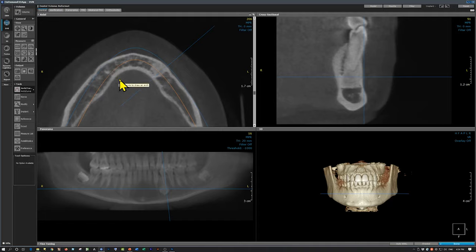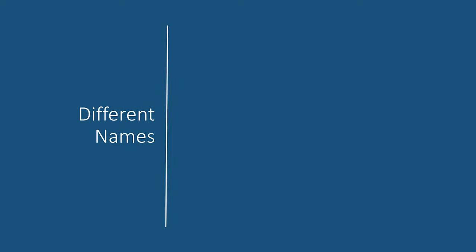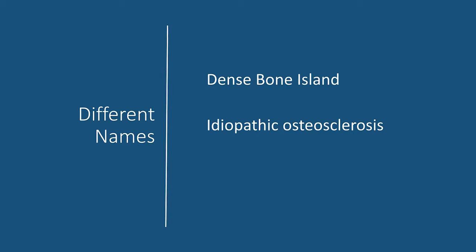This is a dense bone island. The dense bone island has different names — it is also known as idiopathic osteosclerosis. It can also be called an enostosis. Enostosis is the internal counterpart of exostosis. An exostosis or torus is on the outside of the cortical plate, while an enostosis is on the inner aspect of the cortical plate.